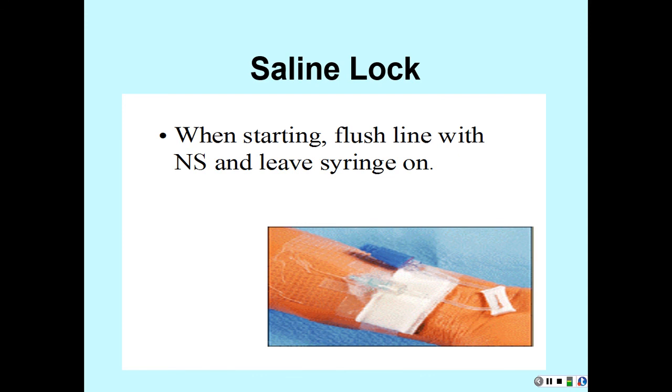If you have a person who's having an outpatient test, let's say a treadmill test, they start a saline lock just to give them the fluid, just to give them the medication. If it's a cardiac stress test, Cardiolite or something like that, adenosine. But you're also using it just in case the patient starts to have chest pain or a heart attack. You've got access to their vascular system. So saline locks are really useful.